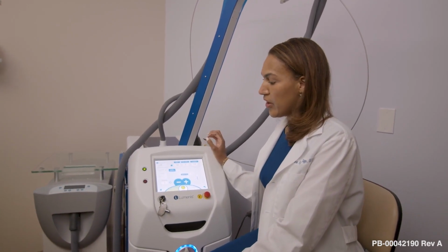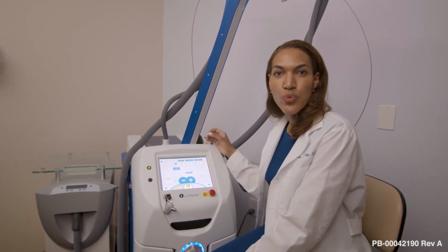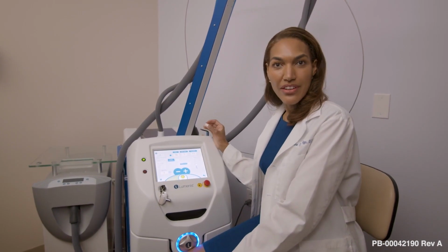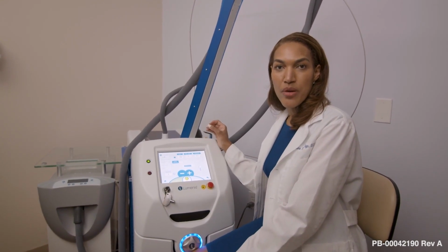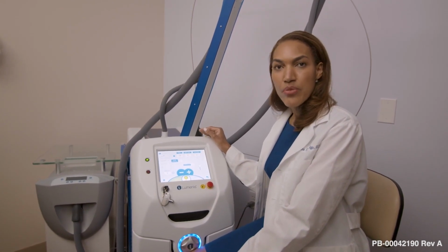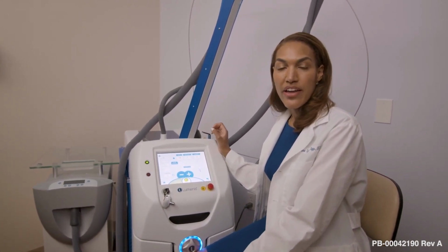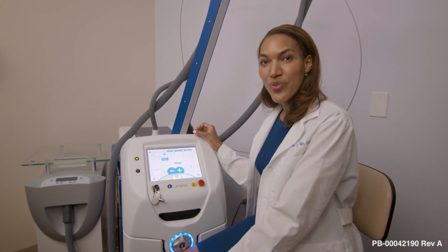So when you first treat, we treat a site and then wait and look at some of these specific indicators about whether it's working well or not. Things such as, do you see immediate crinkling of the hair? You can actually smell a little bit of the hair. I'm listening for a pop sometimes when I'm treating, and then you see the result that becomes delayed. I don't want to see immediate redness. I want to see really not a lot of erythema, particularly in someone of color. And then I might see some delayed edema just around the base of the hair follicle, perifollicular edema. And that usually should happen several minutes later, not right away. But that is actually the perfect result.